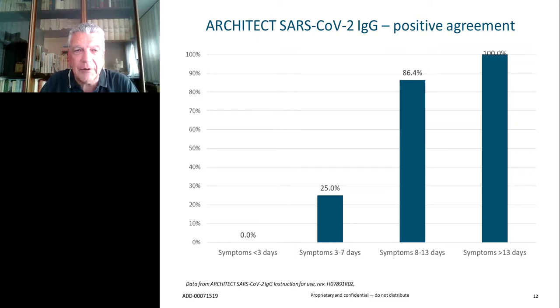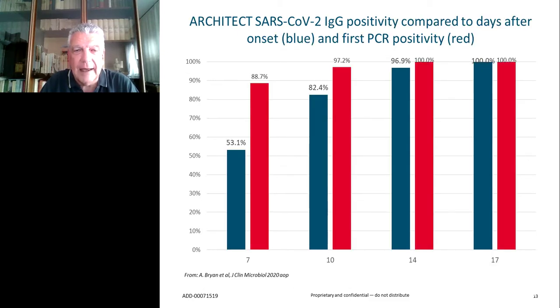And we have another demonstration of that that comes from real practice. When the authors of this paper checked their population, which was quite large because they took samples from more than 400 patients, and they compared the positivity rate by that assay with the time after the onset of symptoms, they basically found the same values that we have seen before, with an increase over time. If you wish, quite surprisingly, they did find antibodies already in 50% of the population after just 1 week. And then when they compared the results, not just to the days after the onset, but to the first positive PCR, the yield was even higher.